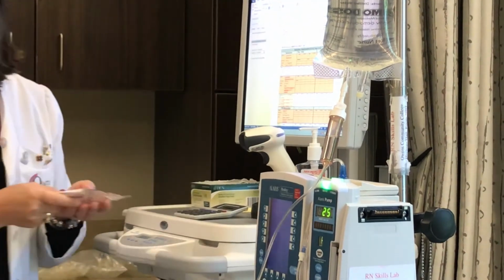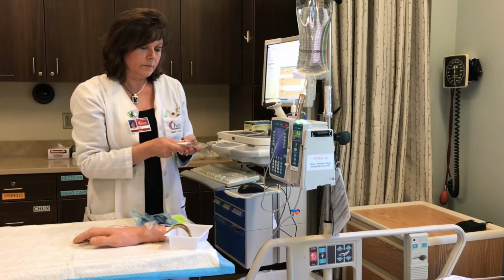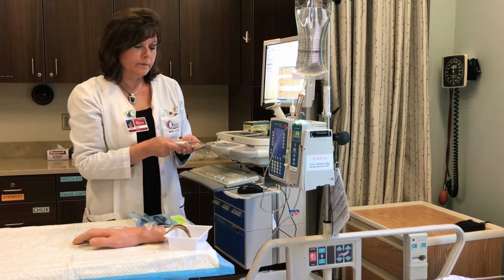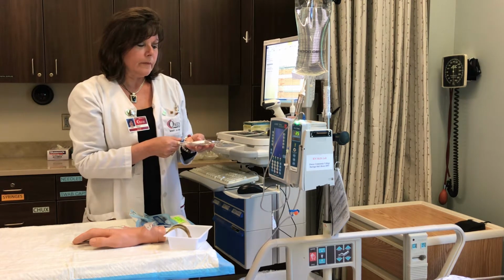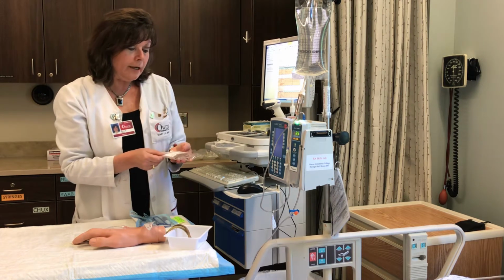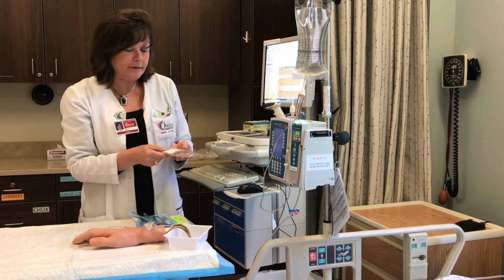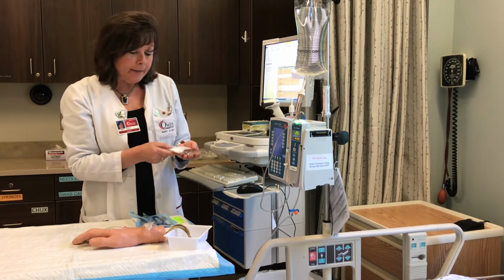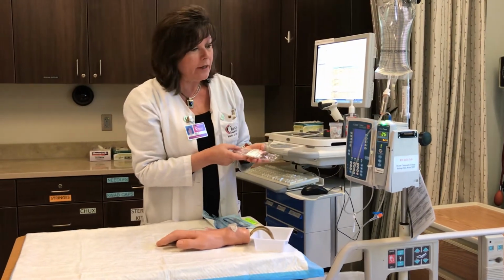Discuss the purpose of the medication, its action, possible adverse effect. Explain that you will give the medication through the patient's existing IV line. Allow the patient to ask questions. Encourage the patient to report any symptoms of discomfort at the site. Ms. Curtin, I'm going to be hanging your IV piggyback, which is an antibiotic, through your existing line, so we will not need to poke you again. I will be running this through the IV. Do you have any questions?